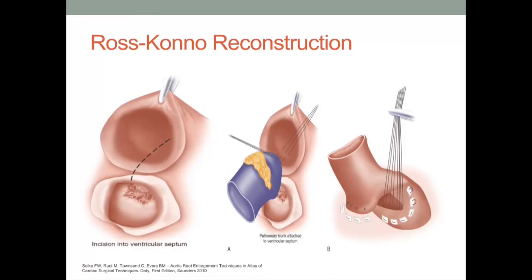A small right-angle clamp may be passed well below the pulmonary valve annulus and gently pushed through the right ventricle anteriorly. The right ventricle is then divided well below the annulus with direct visualization of the pulmonary valve leaflets. Sharp dissection of the ventricular septal region is accomplished to separate the pulmonary trunk from the right ventricle and done in a fashion to ensure protection of the first septal branch of the left anterior descending artery.